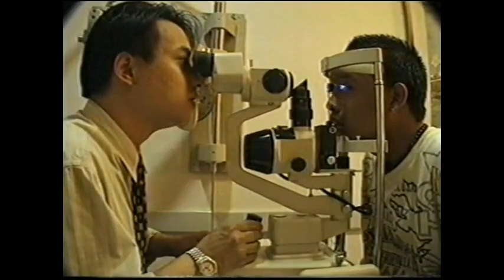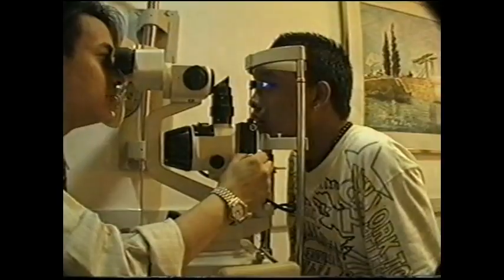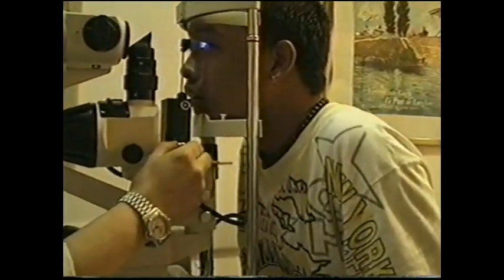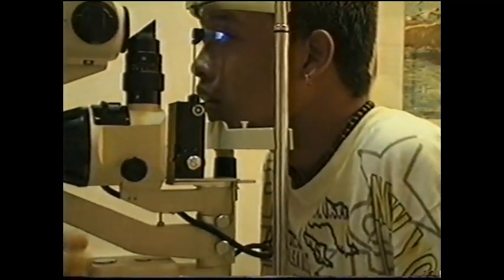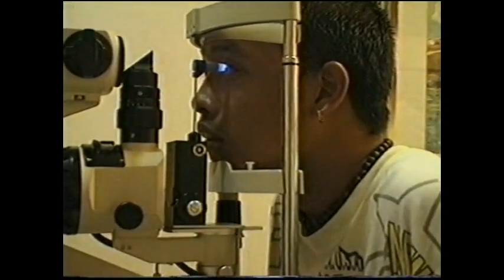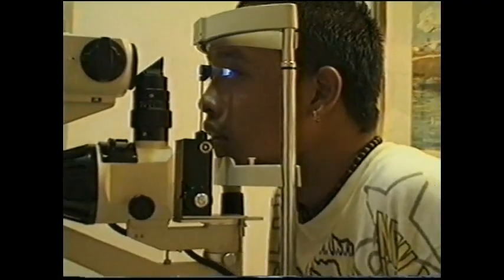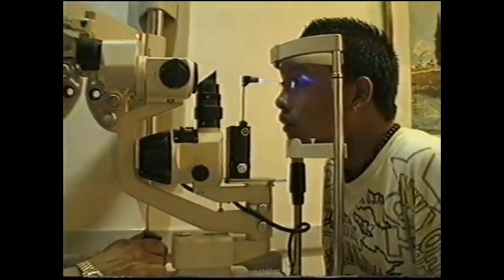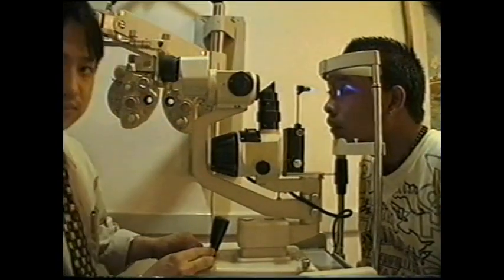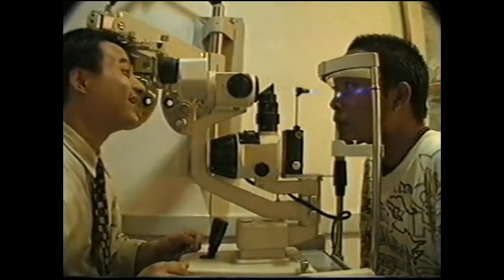The examiner should be seated facing the patient behind the slit lamp oculars. Position the cobalt filter in front of the slit lamp illumination device. The cobalt blue light causes the fluorescein dye on the patient's eye to fluoresce a bright yellow-green. Set the magnification of the slit lamp at low power with the light beam at high intensity and shining on the tonometer tip at a wide angle. Looking from the side, use the slit lamp control handle to align the tonometer tip with the patient's right cornea.